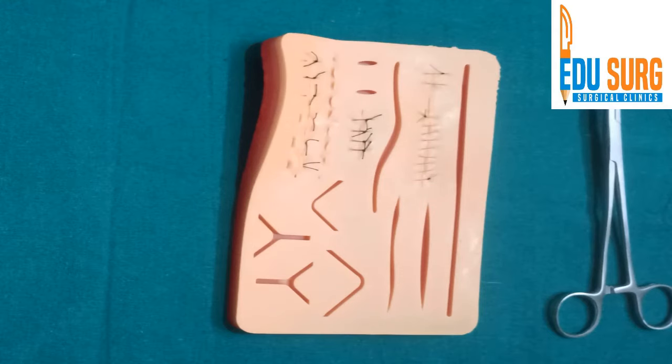Hello everyone and welcome back to Edu Search Clinic Skill Station. I am Dr. Gunjan Desai and today we are going to briefly see how to remove sutures.